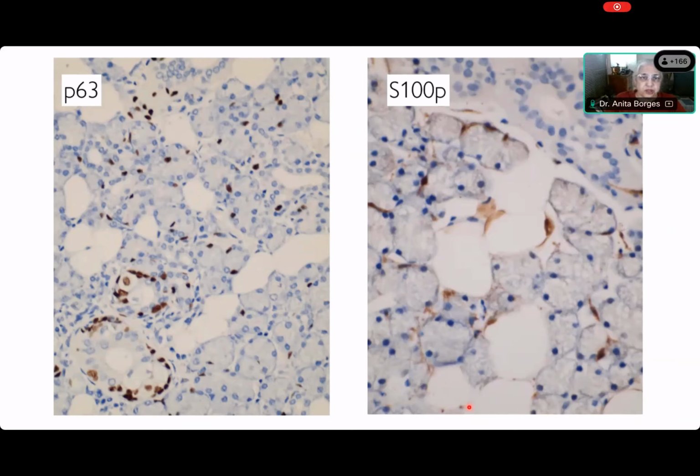Well, what we are doing in the prostate is that if there is a basal layer, and P63, as I've just told you, marks the basal cells as well as myoepithelial cells. So there are no myoepithelial cells in the prostate. I hope everybody gets that. So what are we looking for? We are looking for some sign that those atypical acini that we are seeing in the prostate are truly neoplastic acini. And neoplastic acini will be devoid of basal cells. So we're looking for the presence or absence of basal cells in acini in the prostate. Why? Because if the basal cells are present, then that's a benign acinus.